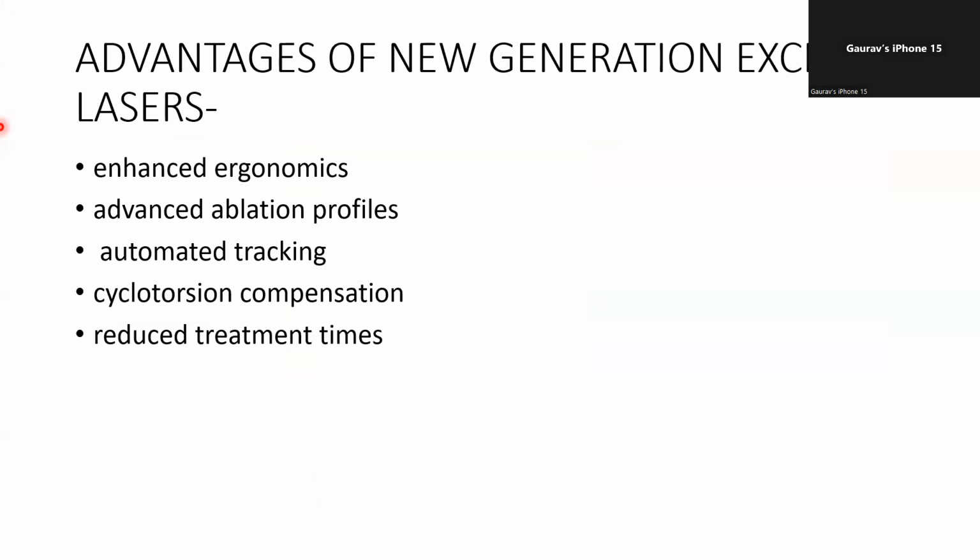Coming to the advantages of the newer generation excimer lasers, they have enhanced ergonomics, they have advanced ablation profiles, there is automated tracking, and there is cyclotorsion compensation, which all leads to reduced treatment times.